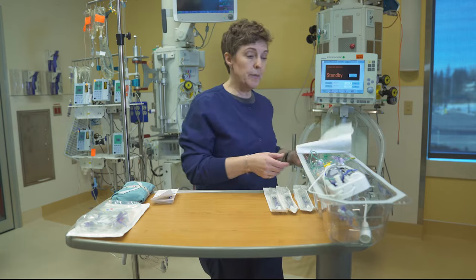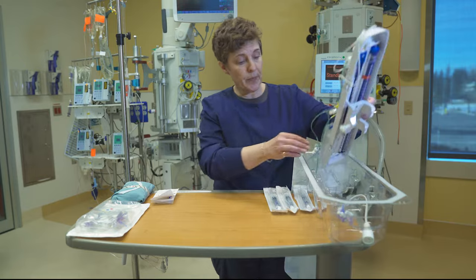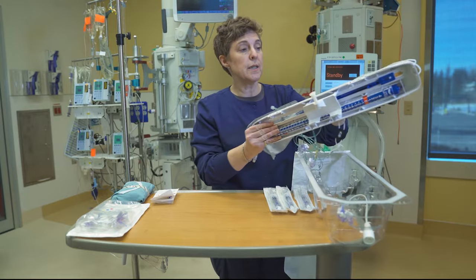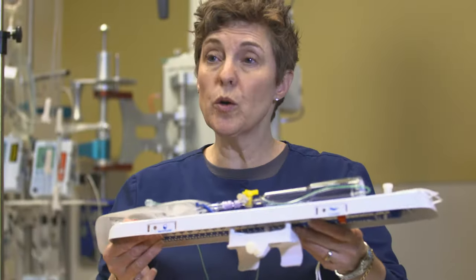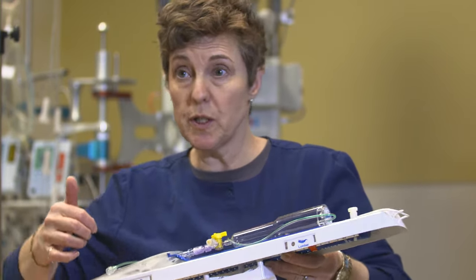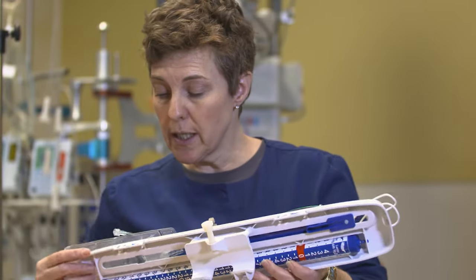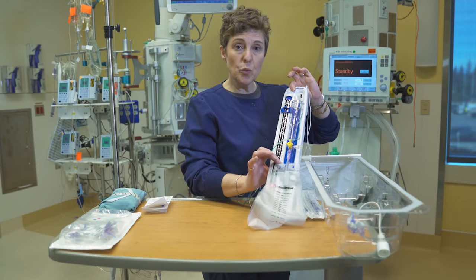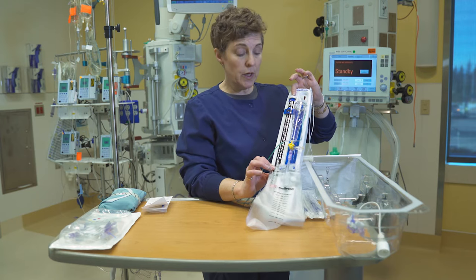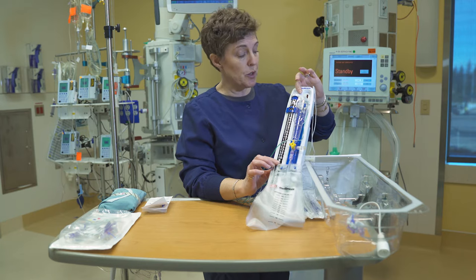When you open your system there are a few things to remember. The first is that you need to know where you're going to be monitoring — whether that's going to be ventricular, which is what we're doing today, or whether that's going to be lumbar. On this system it's very clearly indicated with a little head and a little lumbar spine, so make sure that you get the right one. Once you've established which area you're monitoring, you also need to choose the correct measurement.